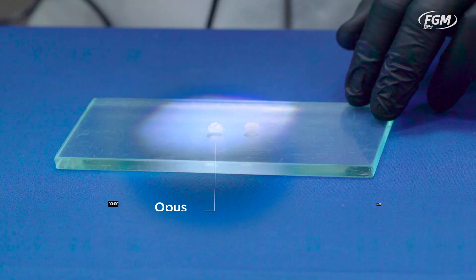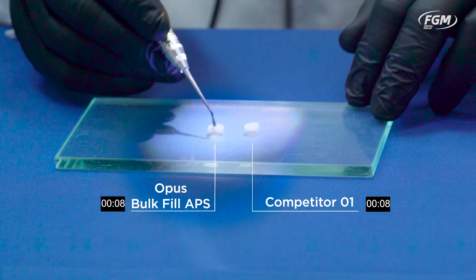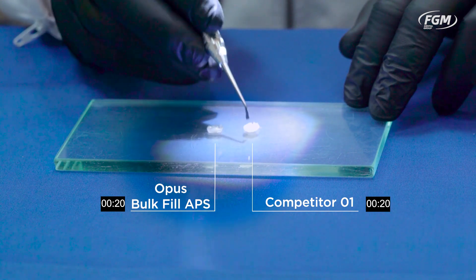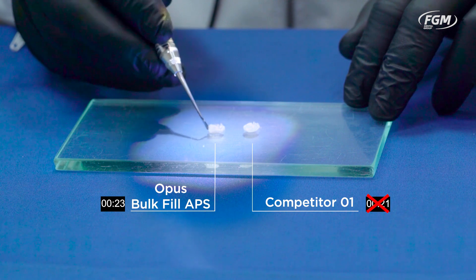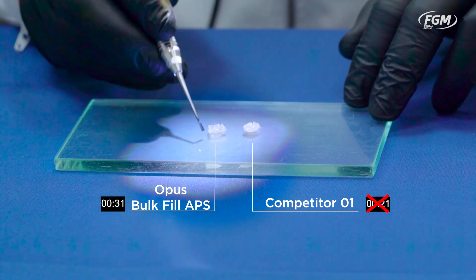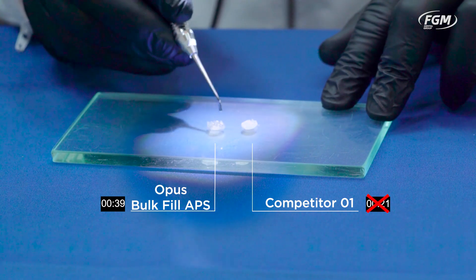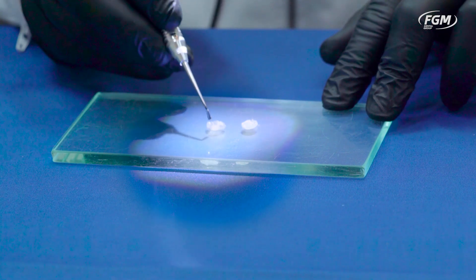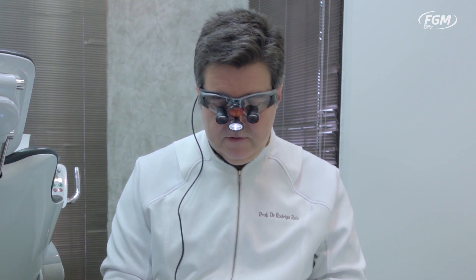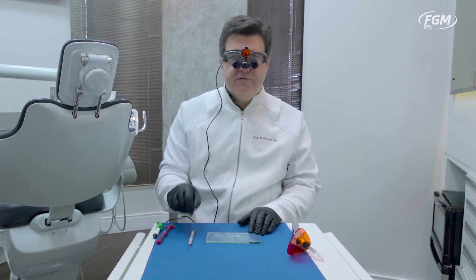I'm going to remove my filter. Wait a few seconds. This one is starting to lose plasticity — gone. APS is still doing fine. So you have a little extra time under a well-illuminated operatory light to remove excess when you're carving your bulk fill composite. See, this one is hard, while this one still has a little bit of plasticity. And even under a strong setting of the loop light, you can dim it to a low intensity and have even more working time.